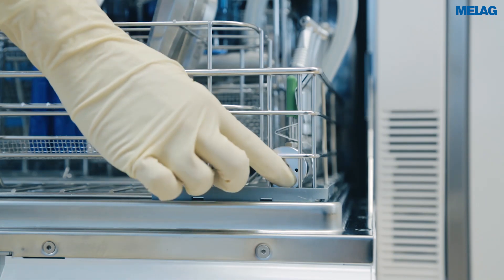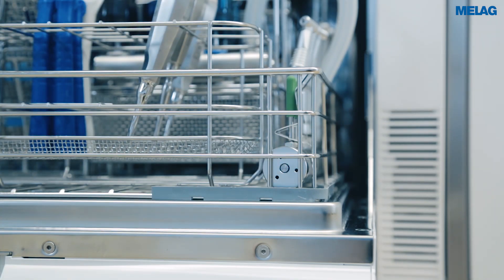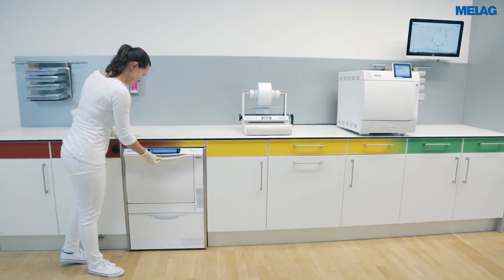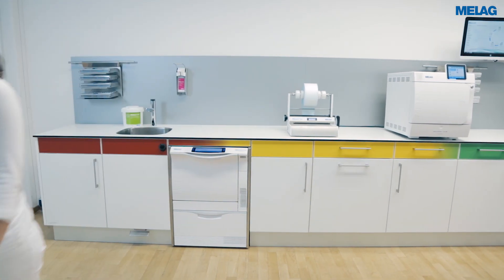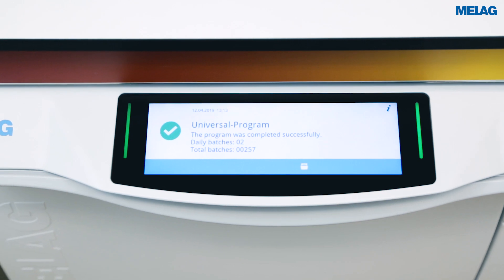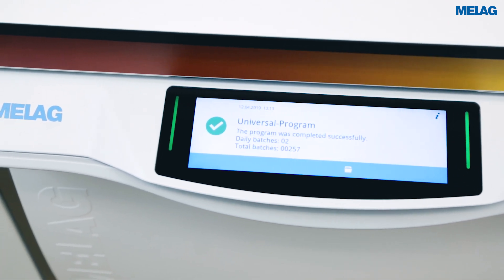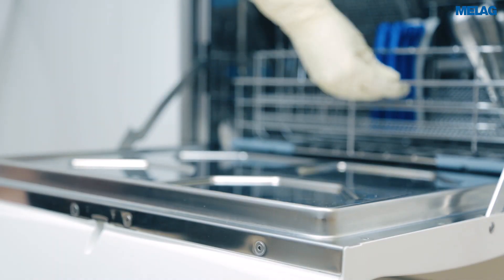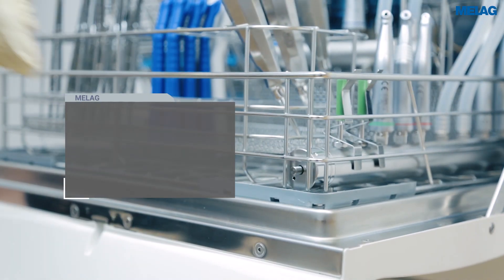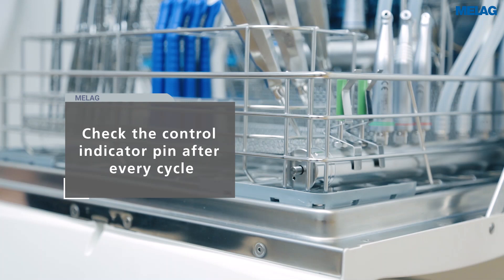Press the pin of the control indicator before starting a program to check the filter performance. If the pin protrudes after completion of the disinfection program, the central filter can be used further.